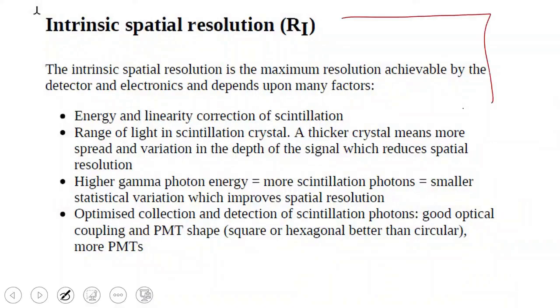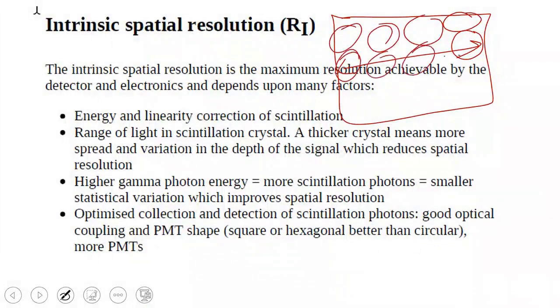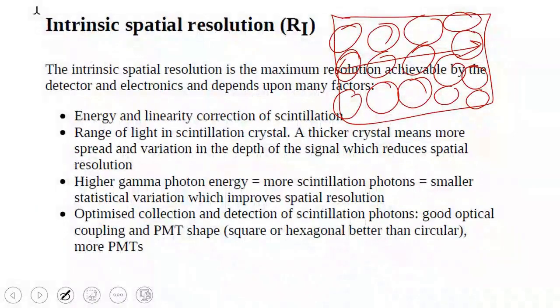My crystal has a specific field of view, and it has certain dimensions. Now, is it true that all these crystals have photomultiplier tubes on top of them? Am I currently exposing a source of radiation to the crystal? Are all the photomultiplier tubes, all the pixels, and all the points inside the crystal seeing this source correctly, or is there variation?